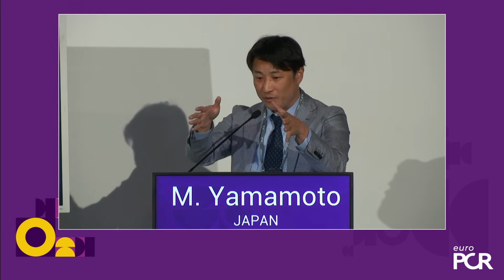Thank you very much. It depends on the shape and structure of the bioprosthesis, I think. For example, with the supra-annular self-expanding valve, if we choose a 23 millimeter device, the distal part is 23, but the waist is 20.